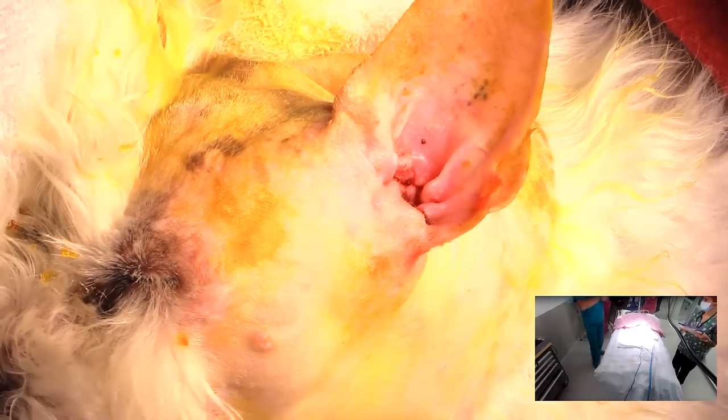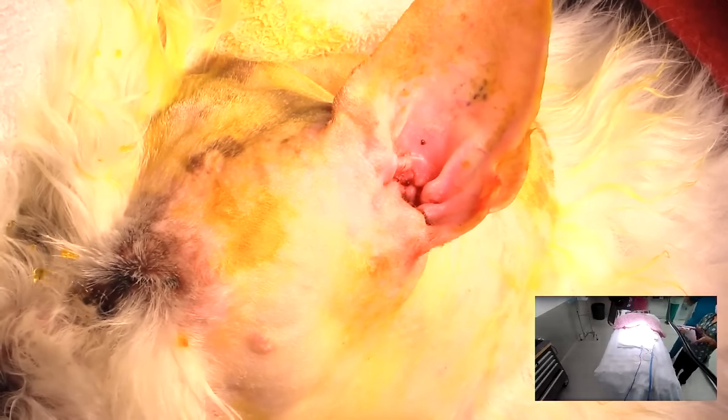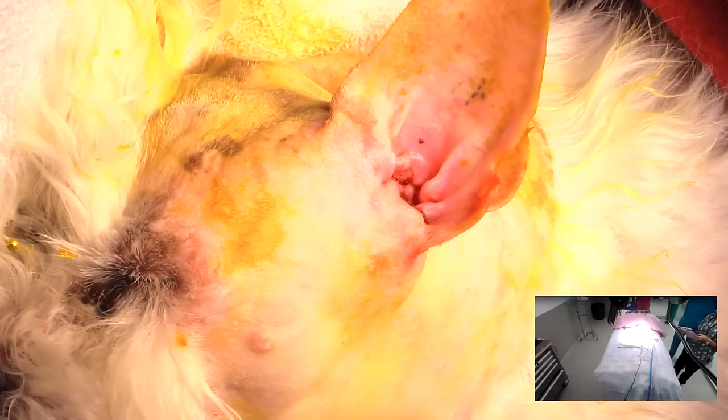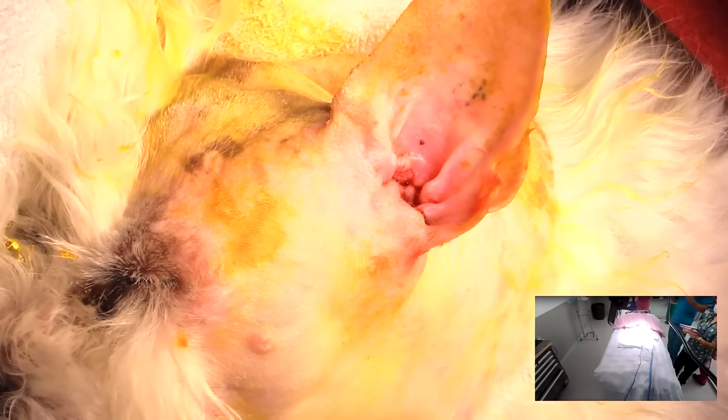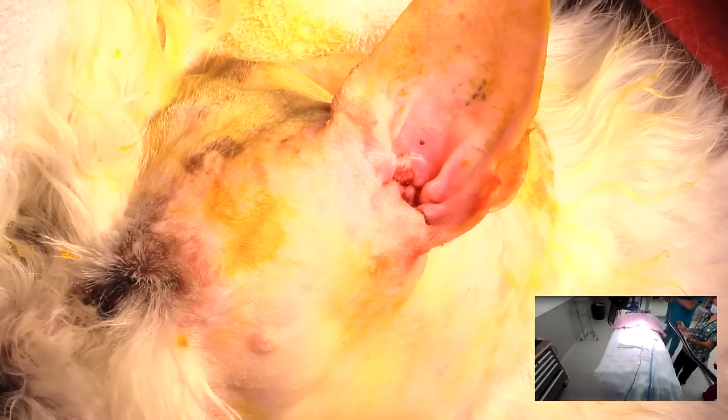Yeah, so we're going to go through our pre-surgical checklist like we do every day, and I'll just read those out loud as we go. The first thing we want to do is check to make sure our ground plate is connected. If our ground plate is not connected, there's potential for pretty severe burns to the skin. So we make sure that the ground plate is connected on the patient, and then to the electrocautery machine as well, which it is.